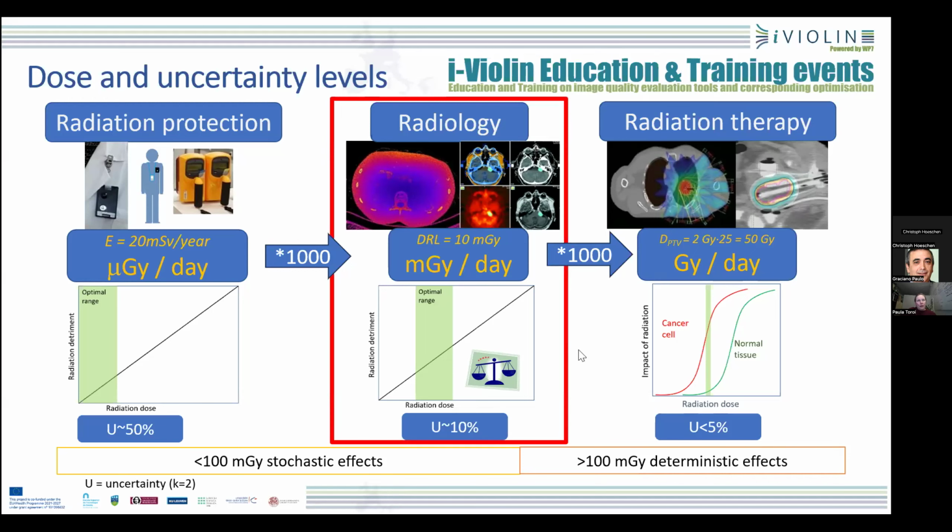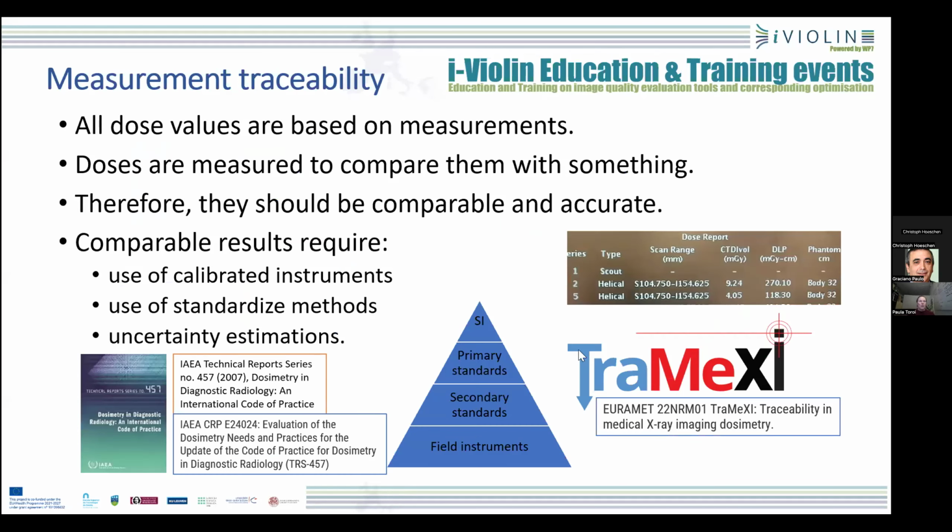In radiology, we have all measurements. We actually have all those values which we have in displays, or the requirements, or those diagnostic reference levels. When we want to estimate the dose, we always need some measurements. So all those displays are based on some measurements. And when we do measurements, we need some dosimeters.